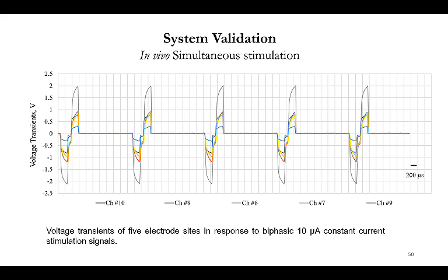Each electrode has a different response, depending on which tissue is interacting. We don't exactly know how the electrode interfaces with the brain, and some of the electrode shapes are a little bigger than others. Because of that, even if we apply the same current, we see different voltage transient responses. That helps us determine whether our stimulation signal is safe or not.